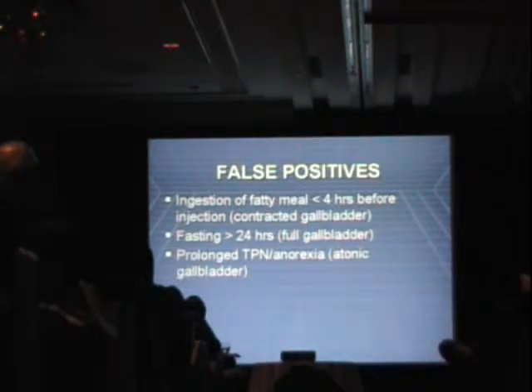There are false positives with the study. It's a very small group of patients, and they're patients that have eaten just before the study. For these patients, you simply wait until 4 hours or more have elapsed. They have a contracted gallbladder because the endogenous CCK was secreted after the meal. Patients that have not eaten within the last 24 hours may have a dilated gallbladder that's already filled up with bile. It's hard to fill this gallbladder.